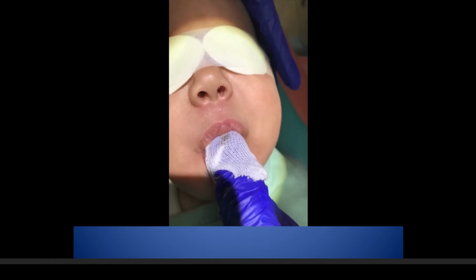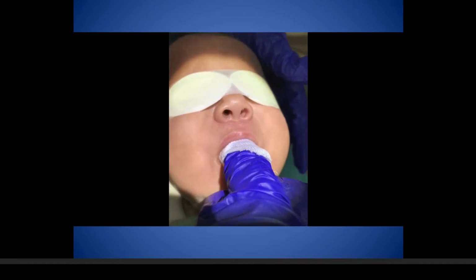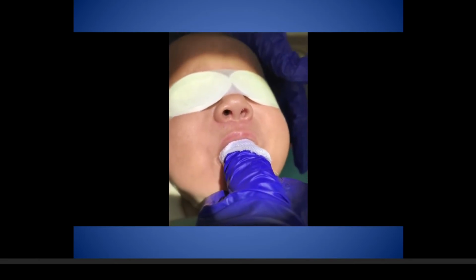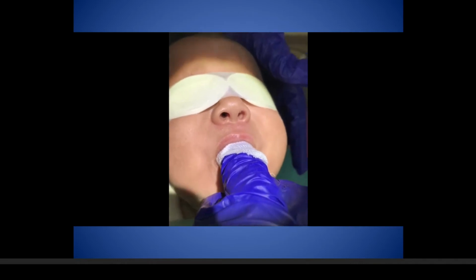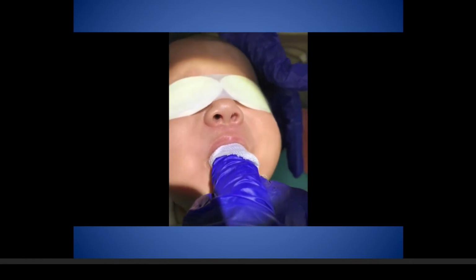So how do we get from here with a poor suck to here? Notice you cannot see the lip blister anymore because the baby is flanging over my finger much more successfully because the lip tie has been released. Notice the baby is not coming off of my finger, not coming off of mommy's nipple, being able to suck more efficiently and effectively, and notice the masseters working in tandem.